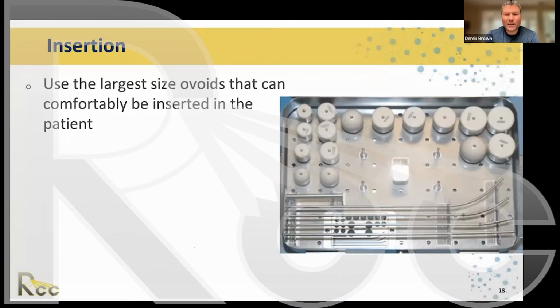You may, in some cases, depending on the size of the patient, depending on the quality of the image, be able to see the uterus and some of the anatomy. Just difficult to dose optimize. So I think the answer is yes, you would be able to see in most cases, given good image quality, that it was placed correctly.